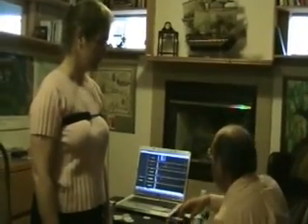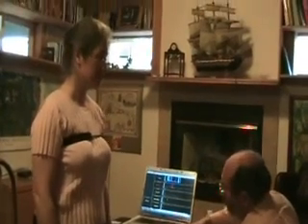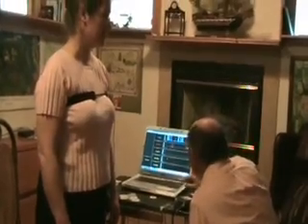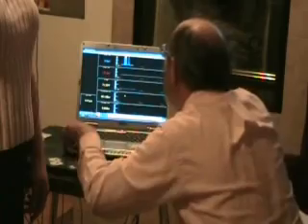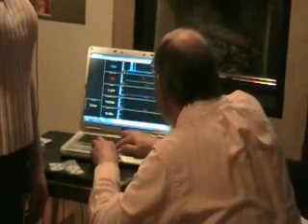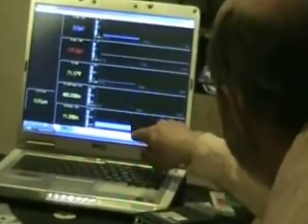And now we have to check the recording. The way this device works is the screen tells us which socket to plug which sensor into. So we know simply by double checking that respiration is in the right socket. And now what we have to do is get a signal. So respiration is at the bottom. Barb, breathe in and out deeply so we can see whether it will go up and down. Okay.